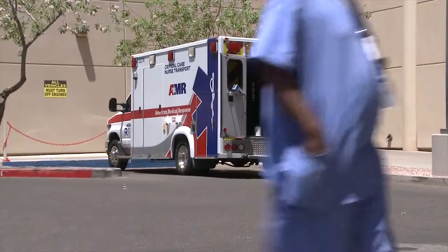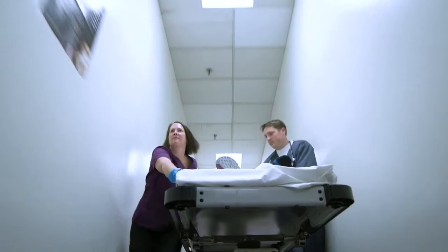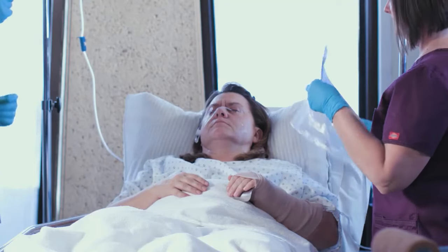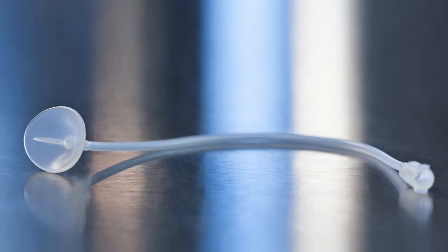Transporting your patient to or throughout the hospital is possible without having to stop the irrigation process. Just like over 90% of the emergency departments in the United States, you should be using the Morgan lens.